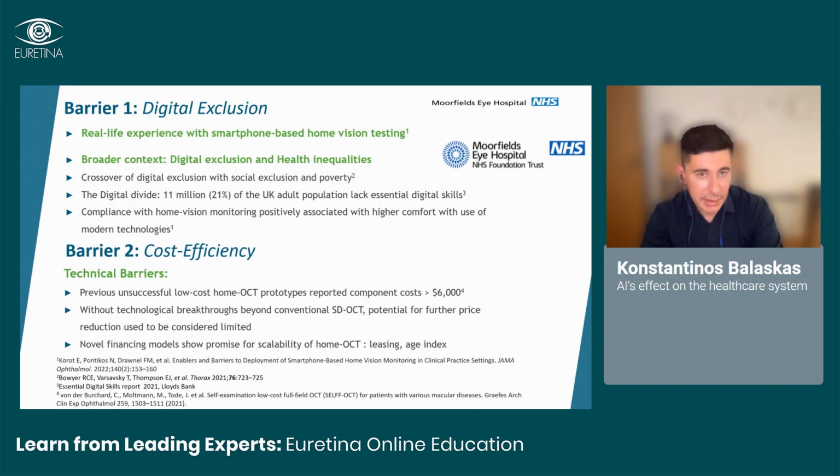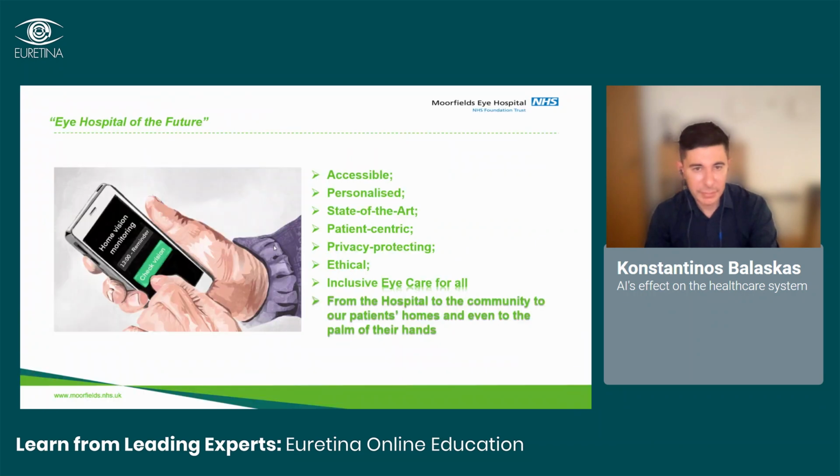There are some barriers that we need to overcome. Digital exclusion that I mentioned, which is associated with poverty and social exclusion as well, and cost efficiency, which might be more relevant to more costly technologies like home OCT, although there is a lot of progress in making this more affordable now.